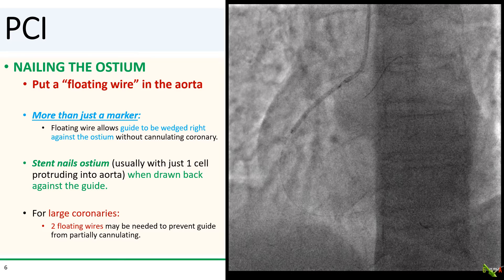Enter the floating wire technique. This technique allows you to nail the ostium without contrast. I advanced a workhorse wire — acting as the floating wire — well out into the aorta. With the floating wire in the aorta, you can wedge the tip of your guide right against the coronary artery without actually cannulating it. By aligning the stent with the tip of the guide, you almost always nail the ostium with just one cell protruding into the aorta. For larger coronary arteries, you might need two floating wires to prevent the guide from partially cannulating the coronary.